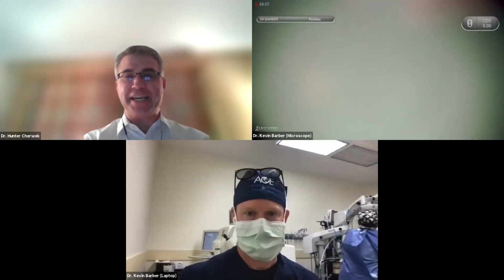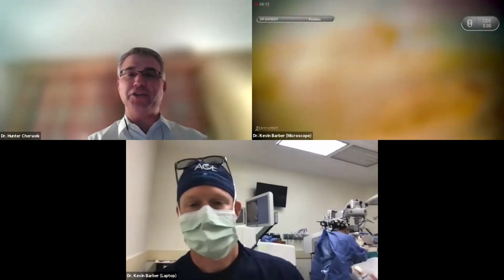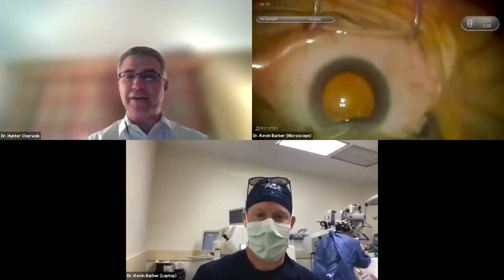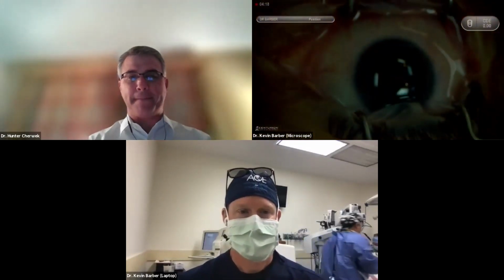We have an exciting day of live surgery. One of our volunteer faculty, Dr. Kevin Barber, is joining us live from Florida. Kevin, welcome. Tell us a little bit about the day today and what cases you've prepared for us.